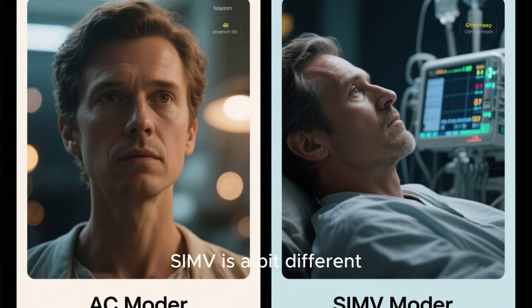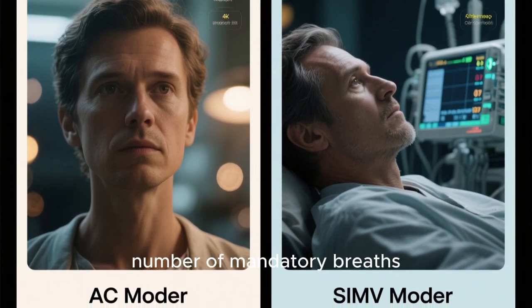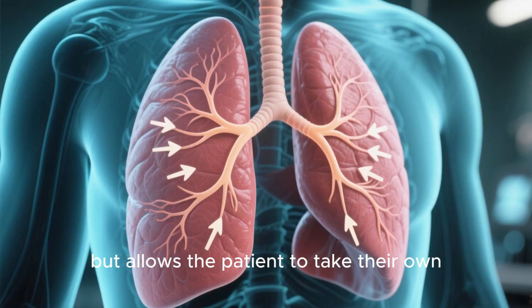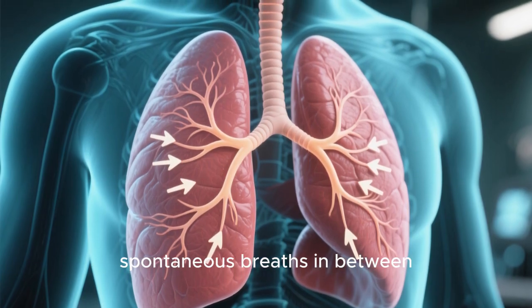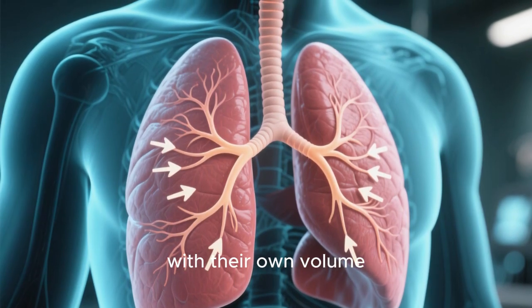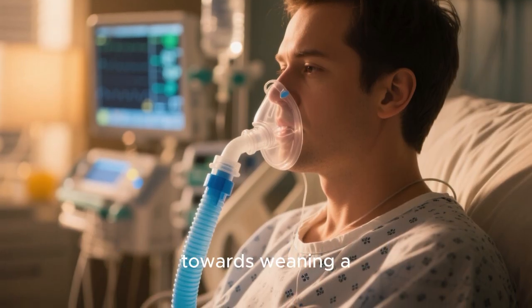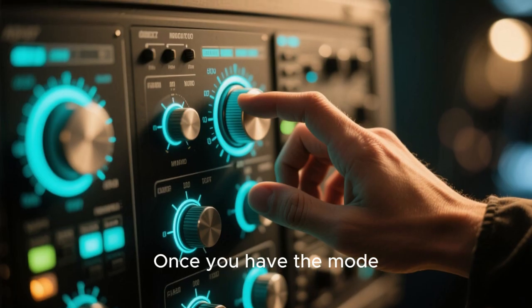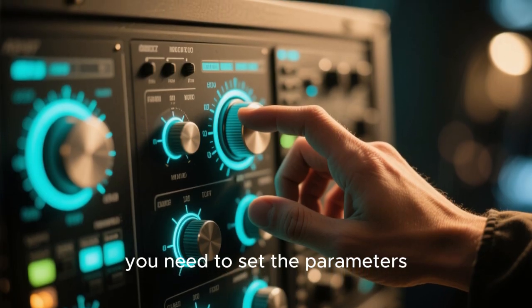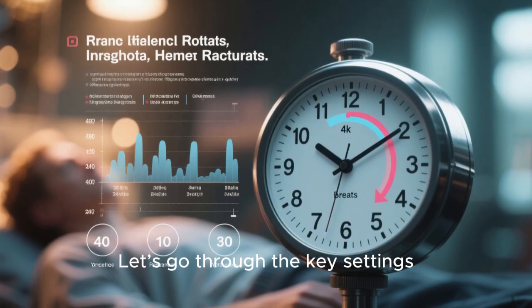SIMV is a bit different. It delivers a set number of mandatory breaths, but allows the patient to take their own spontaneous breaths in between with their own volume. This mode is often used as a step towards weaning a patient off the ventilator. Once you have the mode, you need to set the parameters. Let's go through the key settings.